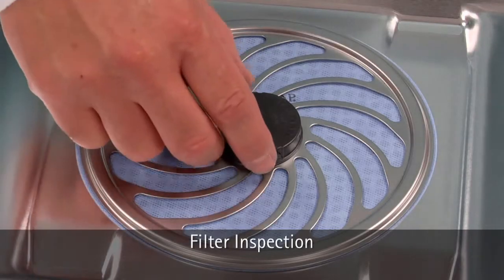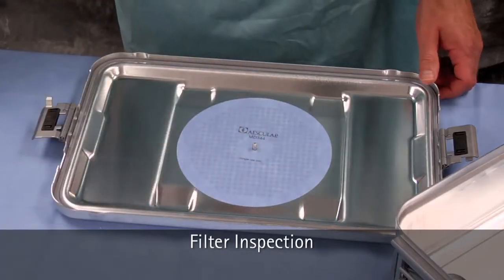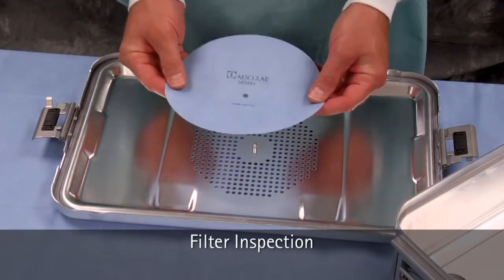Remove the filter retainer plate by pressing in on the two tabs and lifting. Check the filter for integrity.